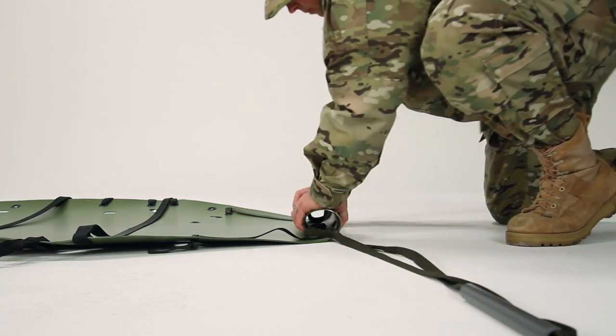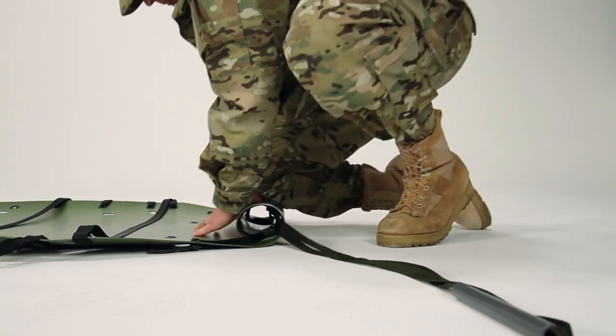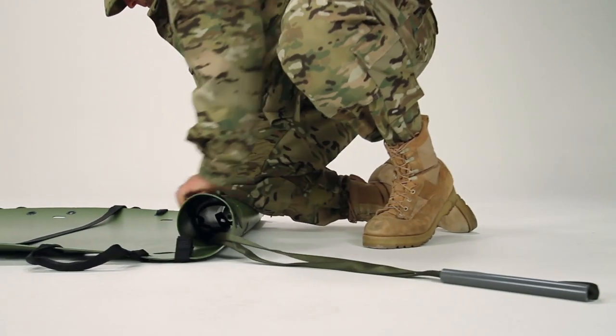Then, using both hands, roll the Sked towards the foot end. Place a knee on the Sked as you roll it to keep it tight.